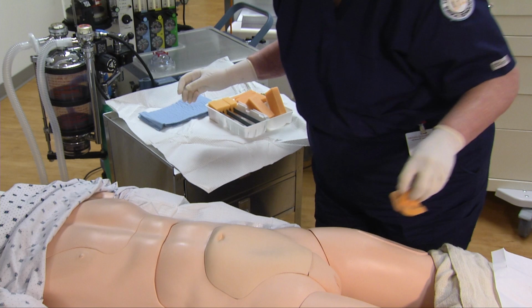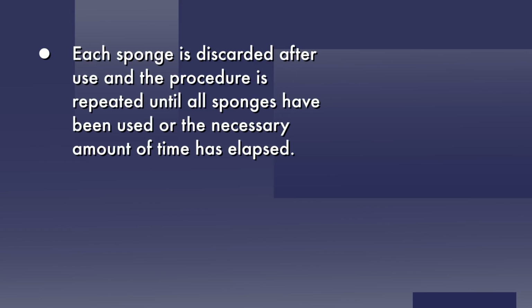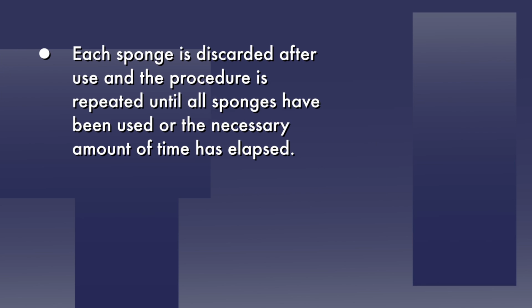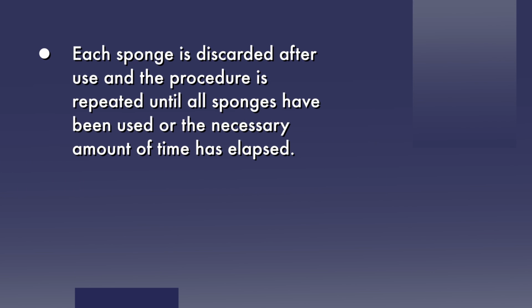The groin is the last area to be prepped with each sponge. Each sponge is discarded after use, and the procedure is repeated until all sponges have been used, or the necessary amount of time has elapsed.